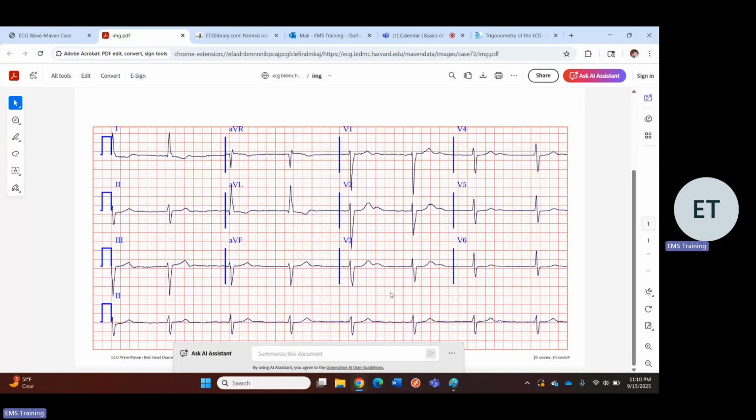Left axis deviation. Is the R wave transition normal? Well, it's down like it should be. It starts to go up. It's almost 50-50 here. But then something weird happens where it looks like there's actually less transition here than here, and then there's more transition again. And it doesn't fully transition upward. So that is very strange. So R wave progression is delayed at best. So delayed R wave transition or progression.